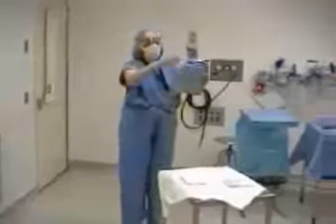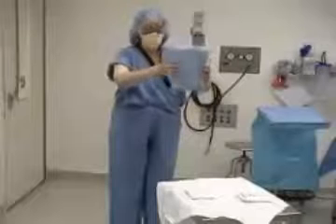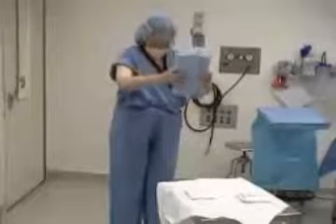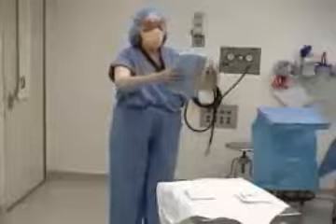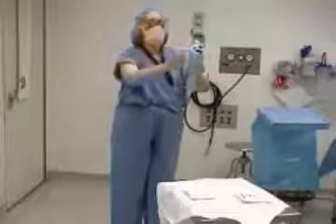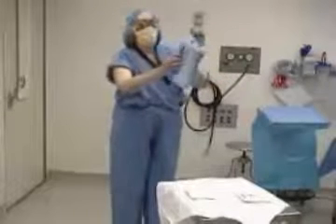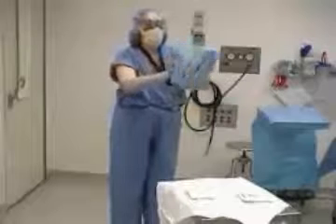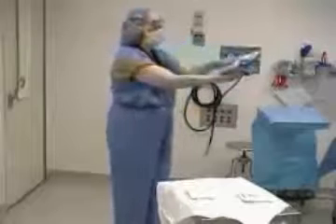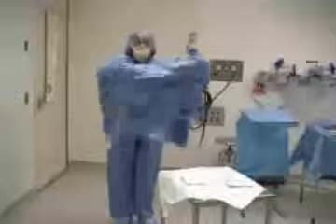Have a look at your gown. This part is the collar. If you end up opening it upside down, you'll have the neck down towards your feet. You want to open it so the collar is upright. Notice there's a white band — these are the arm holes. You want the gown facing so you can fit your hands in the arm holes. You open it and let it drop.